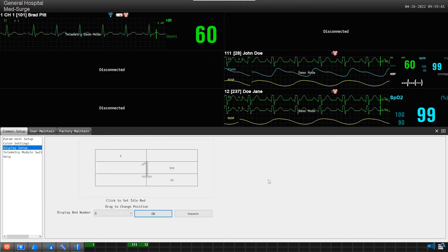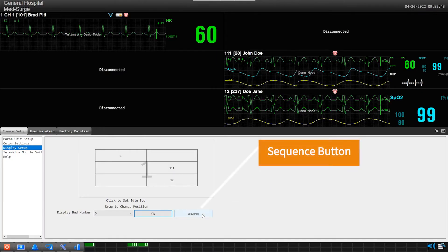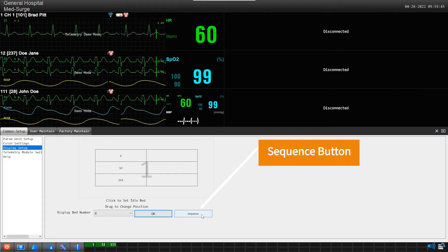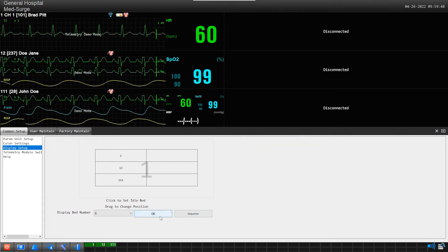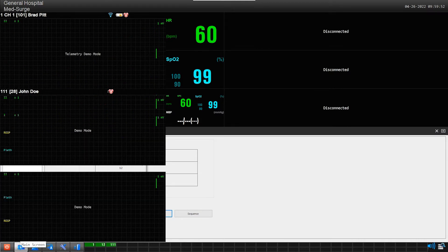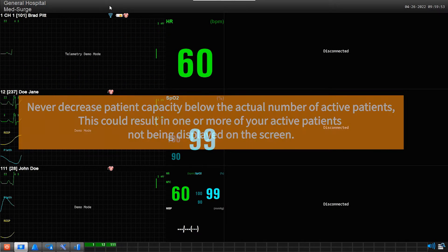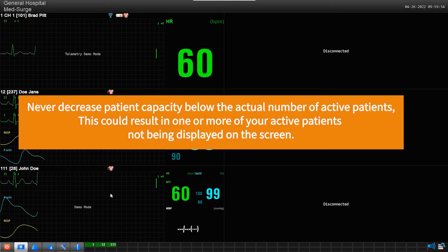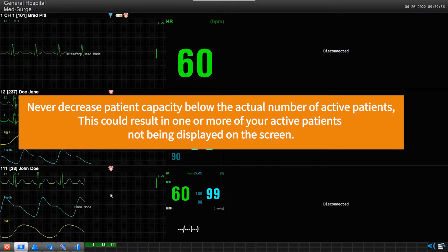Important: When downsizing the screen capacity, it is always a good idea to click on the sequence button first, which will automatically bring all active patients together in sequence with one another. Never decrease your screen capacity below the actual number of active patients. This could result in one or more of your active patients not being displayed.